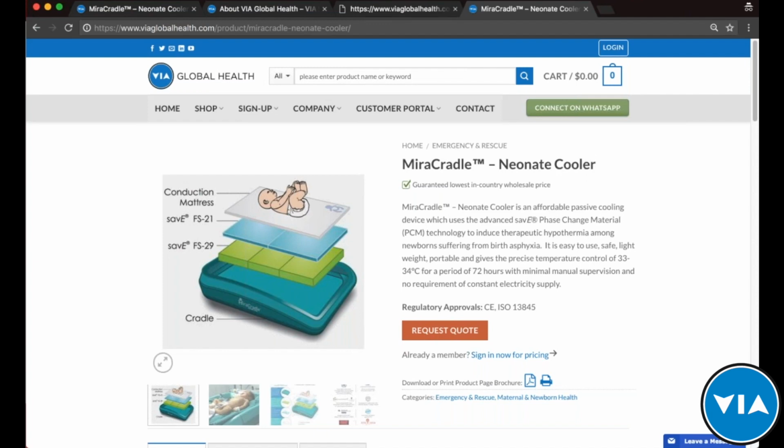Another one, I know you mentioned it's essentially maintenance free. There are two questions that have come up about that. One is, is there any kind of sterilization that can be done? Obviously, I would assume this can't be autoclaved, but should it just be wiped down with an alcohol solution? How should this be sterilized between patients? So the sterilization process has been outlined in the product manual. However, it doesn't really require any special sterilization treatment. You don't need to autoclave it. Just the use of 70% isopropanol alcohol is good enough for the device.